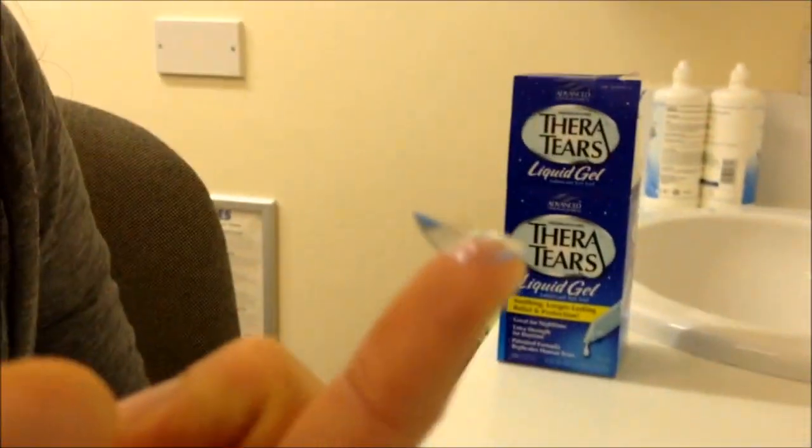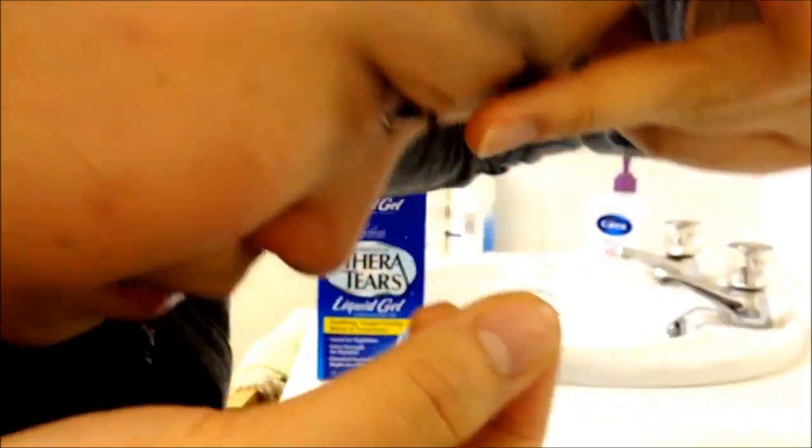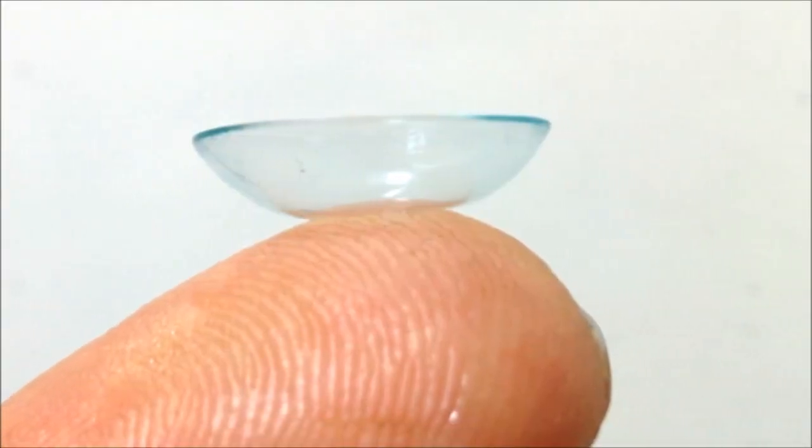To remove the lens, once again hold the lids at the margin with the long middle fingers. Place the index finger and thumb either side of the contact lens, push onto the lens and gently pinch the lens from the eye. It is important to realise that you are only aiming to wrinkle the lens edges slightly to break the suction and allow easy removal.